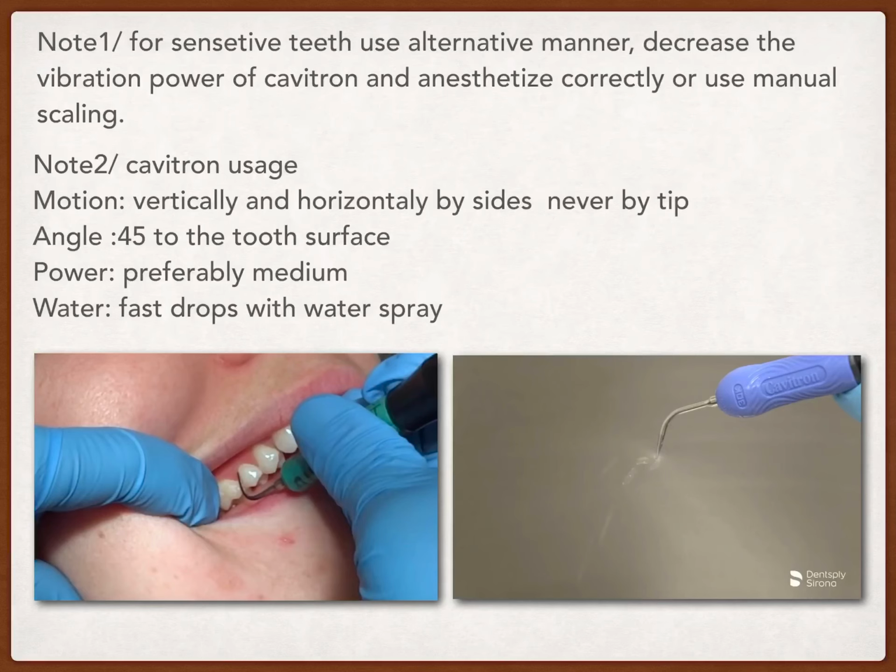The water should be in fast drops with a water spray manner, as you can see here in the lower right picture. There is a fast drop with a mist of water or a water spray. This is the correct amount and picture for the water of the Cavitron.